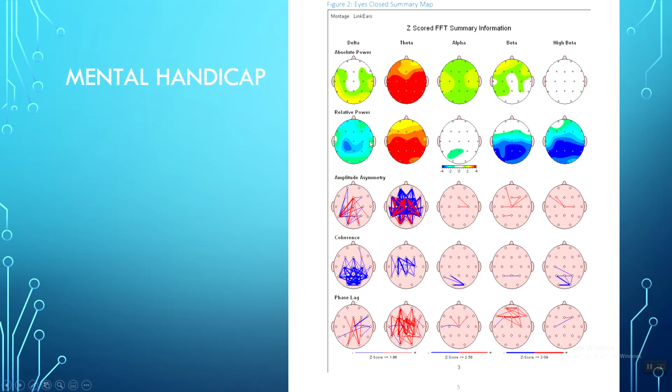When we compare it to how much they do theta, they do way less delta. I'm going to return to that concept. I'll plug it in a couple different times. I like to describe relative power as how you spend your time. So it's where your brain's at, basically, in comparison to beta, this person has so much more, but alpha, that's interesting.